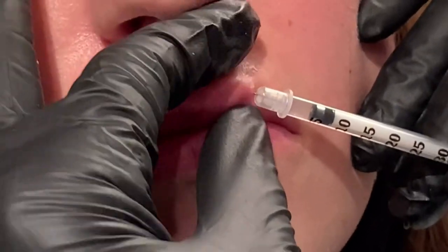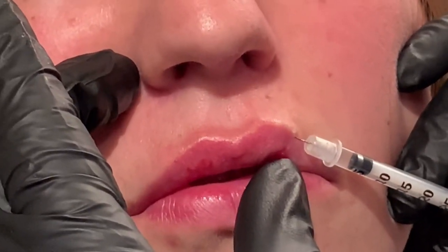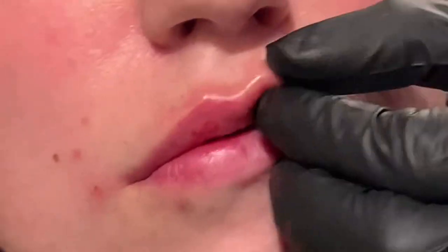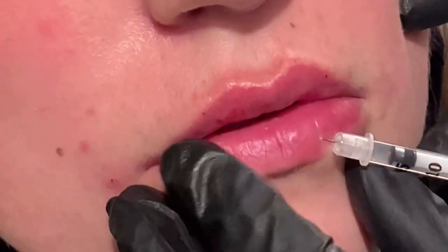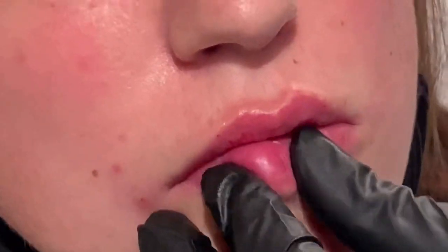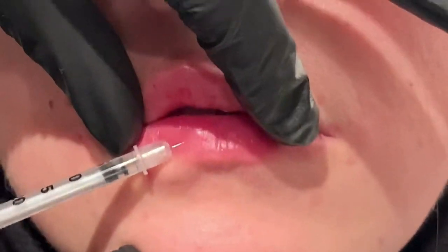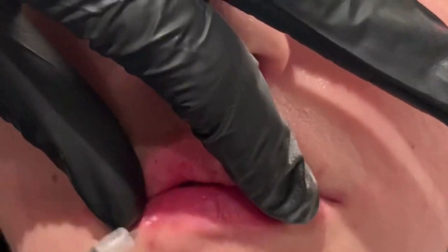As I'm tidying up the last final touches, you may notice that her lips haven't dramatically changed even though I've used a full syringe, and that's because I'm using a pretty fine filler here. But you can absolutely use the same technique with a more volumizing filler. She just wants something to plump her lips up a little bit to increase her kissability factor while keeping them natural, beautiful, and luscious.